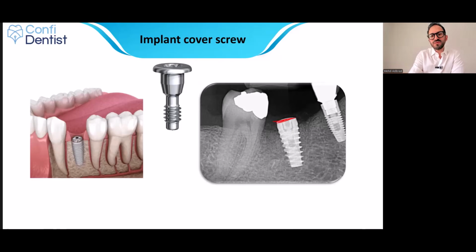So the implant platform. But since it was not placed deep enough, we already see some bone loss or thread exposure from the get-go, from the beginning. Pay a little bit more attention to this area. You can see the extraction socket. And so these granules that you see, they are the bone grafts.